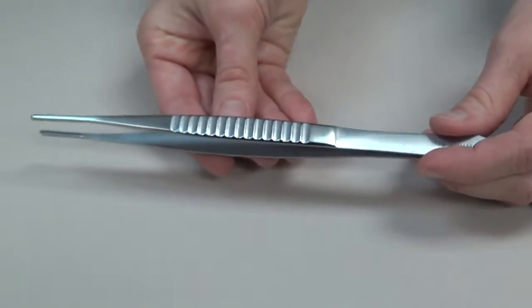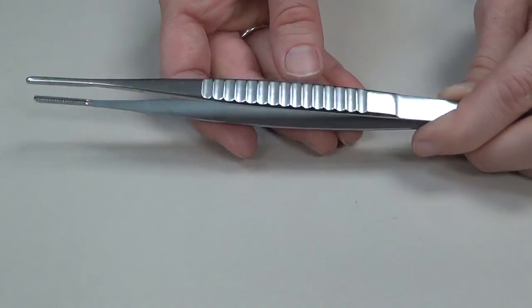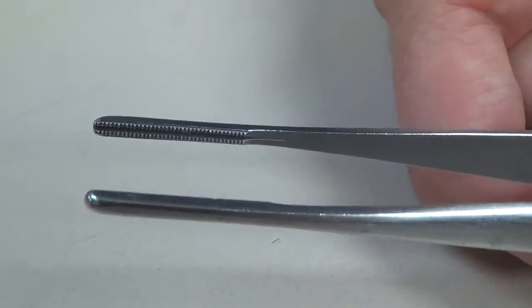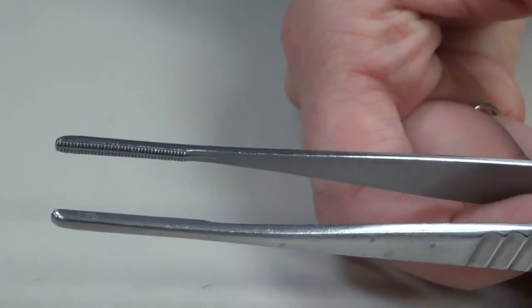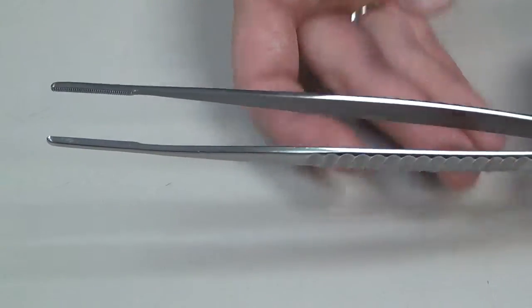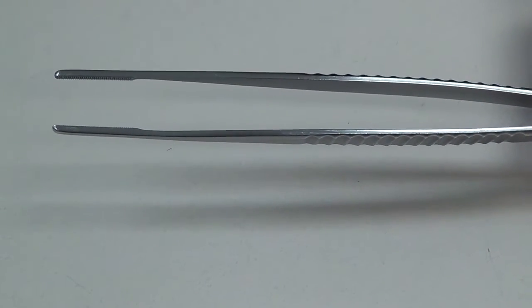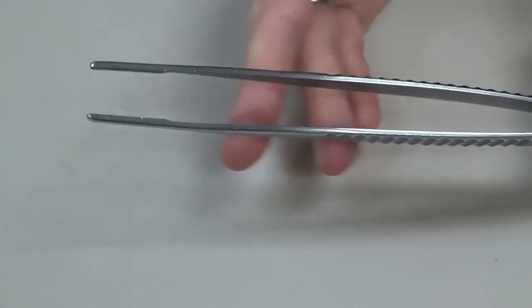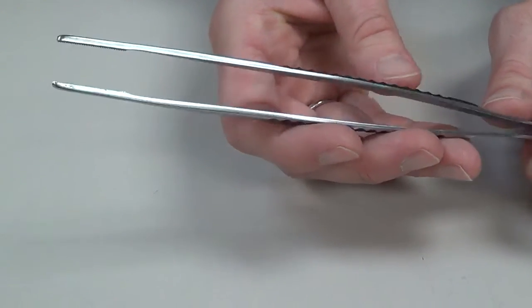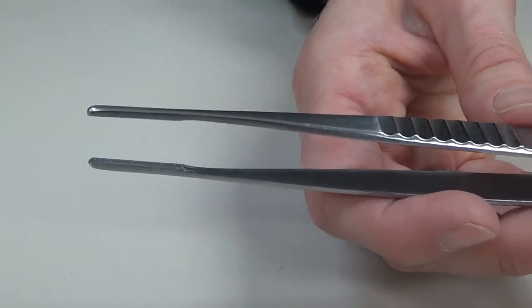The DeBakey forcep comes in multiple lengths depending on where it needs to be utilized. Looking at the teeth on the inside, there are multiple tiny teeth that will not damage any tissue they grab onto — so we refer to this as an atraumatic forcep. We use it on any tissue that could be damaged by a toothed forcep: always inside the abdomen on the peritoneal layer and its contents, on nerves, and always on bowel to prevent perforation. It's a very, very commonly utilized forcep during surgical procedures.